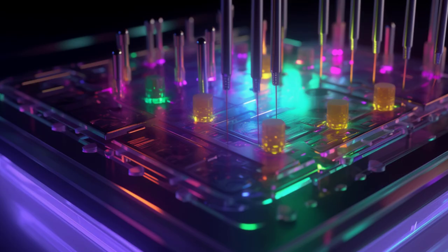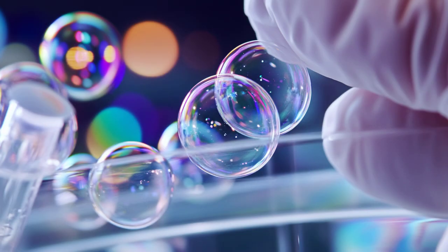You might ask, what happens if the sizes are not controlled? It's similar to baking cookies. If every cookie is the same size, they bake evenly, but if they vary, some might burn while others remain undercooked. Uniformity in microbubbles ensures a consistent and reliable imaging outcome.